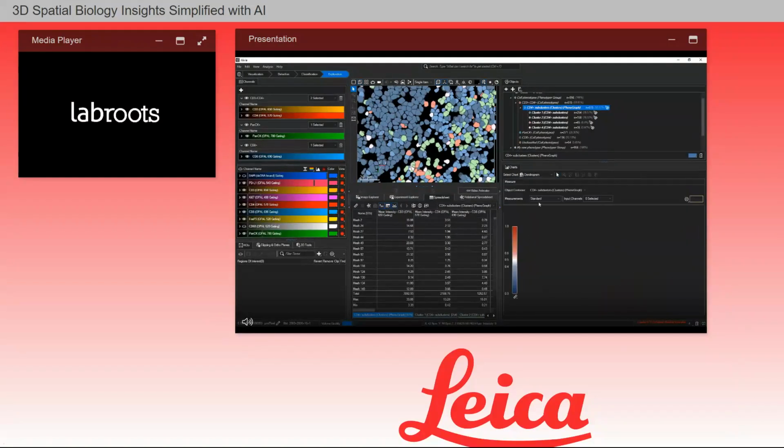In the Dendrogram, I can select the CD4 subclusters as my object container, and then select PDL1, Ki67, and FOXP3 to generate a new dendrogram. Here, you see a grid of colorful boxes. Each box is color-coded with the z-score, with red being the highest and blue being the lowest.